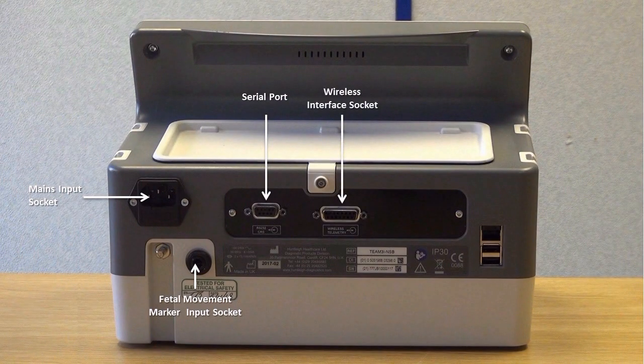A wireless interface socket for connection of the Sonicade Freedom wireless transducer accessory, an Ethernet port currently only used for engineering purposes. Full Ethernet support for connection to software systems is planned for a future software release. Two USB ports are used to upgrade the software, manage the trace database, and for customising settings such as languages and annotations.